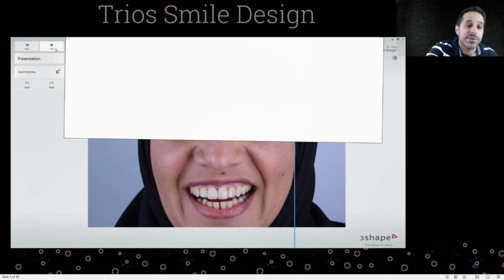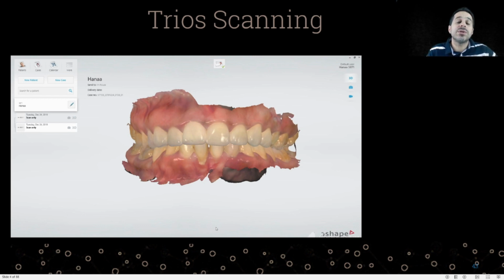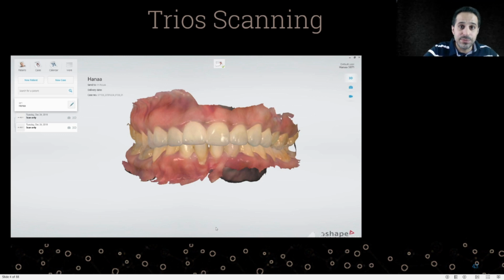From the first visit we have all this information, plus we have the patient's acceptance of your design. Now we are still in visit number 1. It's the day of data collection. After the patient approved, now you can start collecting your data.